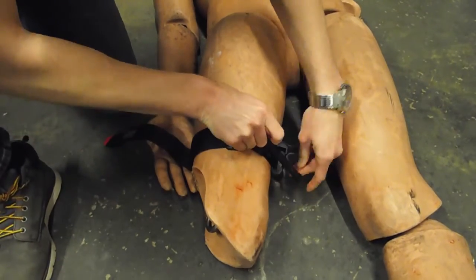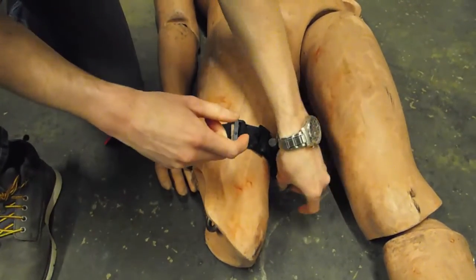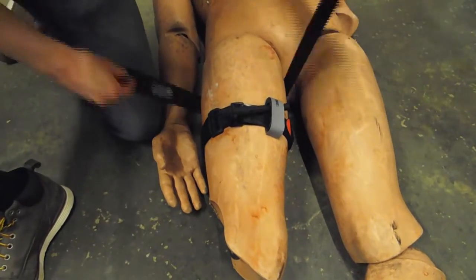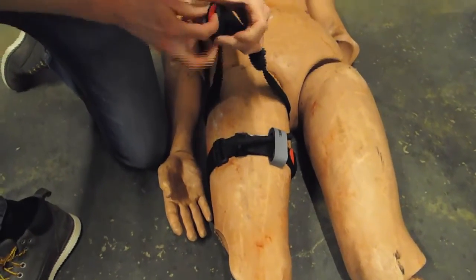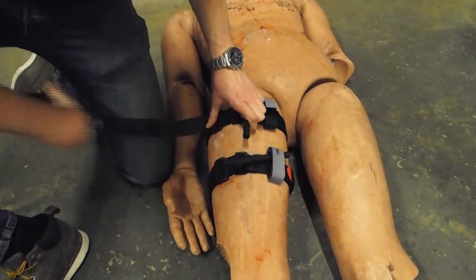Also be aware that on certain injuries there may be mangled tissue near the wound site, so be sure you are applying it to intact skin as best as possible, and never apply it directly over the wound. If you've applied one and the wound is still bleeding heavily, you can apply a second just above the first.